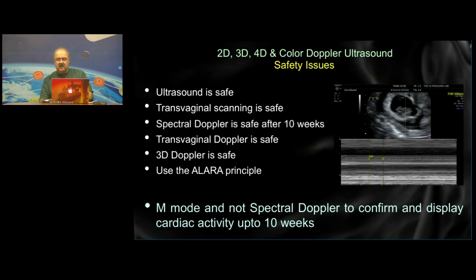Do remember that it's not fair to focus Doppler on the fetal heartbeat for about 10 weeks, because that is energy that might be burning up tissues within the heart. And it's wiser, therefore, to use an M-mode to demonstrate cardiac activity. And let's just use Doppler after 10 weeks for spectral Doppler. For color flow mapping, you could use it earlier, and that's completely safe. Let's start with the good old wine in old bottles.